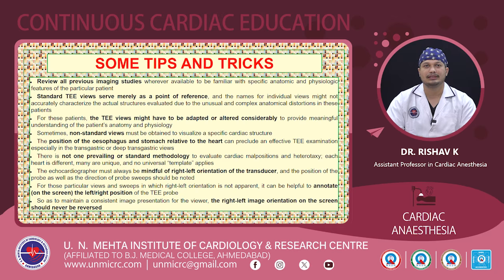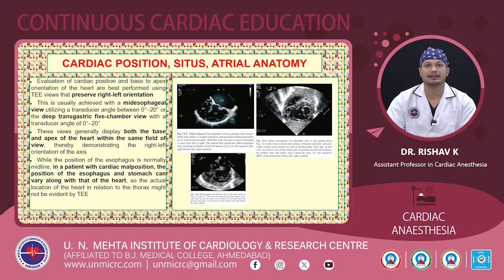Also, very importantly, as we are dealing with abnormalities of right and left lateral orientation, the probe transducer orientation should be very much monitored, and we must be mindful of the right to left orientation. The position of the probe should be noted, and it should never be reversed. The right left orientation on the screen must never be reversed. Where the right left orientation is not apparent on the screen, it can be helpful to annotate on the screen the left right position of the TEE probe.